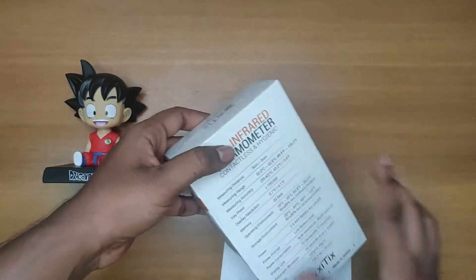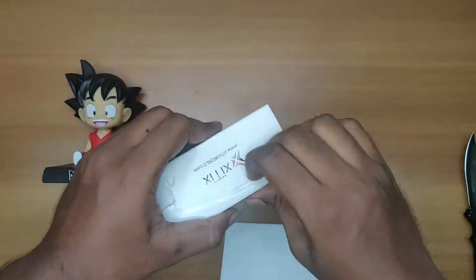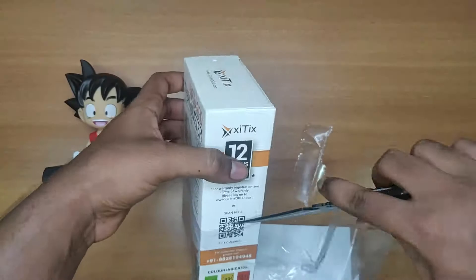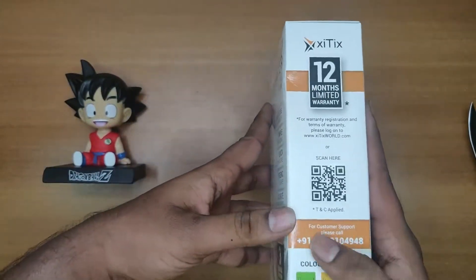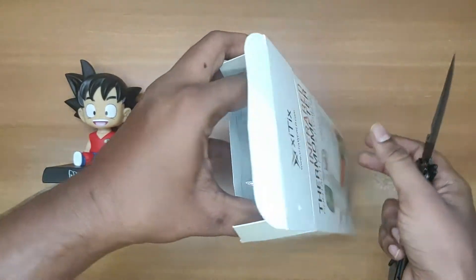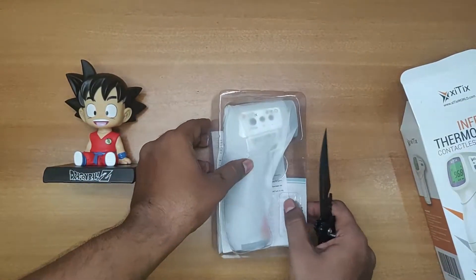So let me see what's inside. Here we got the infrared thermometer.